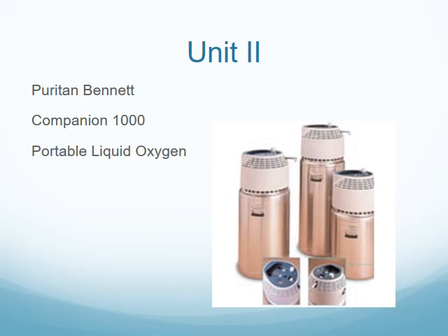In this slide you can see a type of liquid oxygen portable system. It's a blast from the past for me, because it's exactly what the unit looked like when I would go outside of the subacute nursing home to fill up the tanks. So let me see if I can point out how the tank works. You've got the reservoir here that holds the liquid oxygen. They also have a little connection here at the top that my portable tank would connect to, and I would have to push down really hard on that little opening, the valve, and it would fill my tank. I had to turn my little tank container upside down to connect like a puzzle piece into that area.